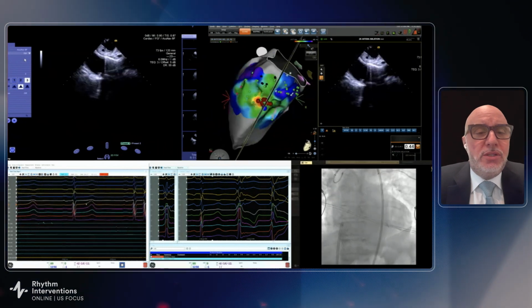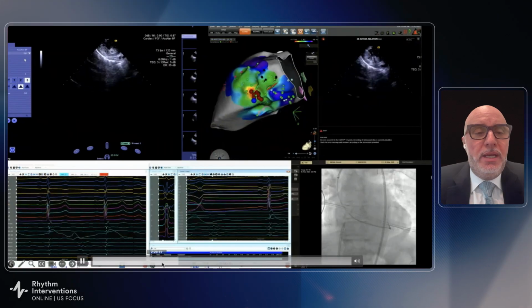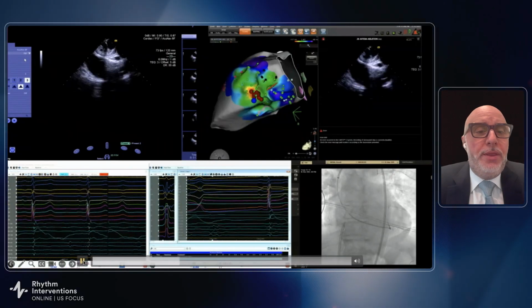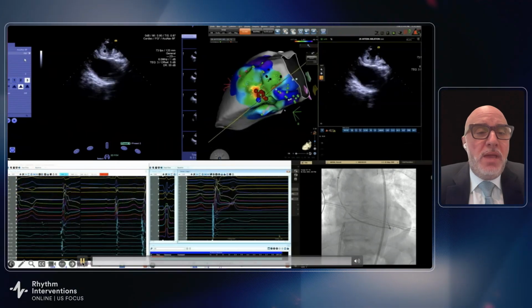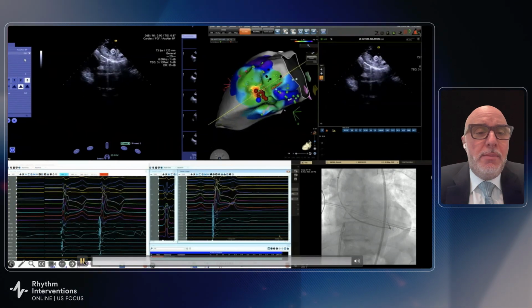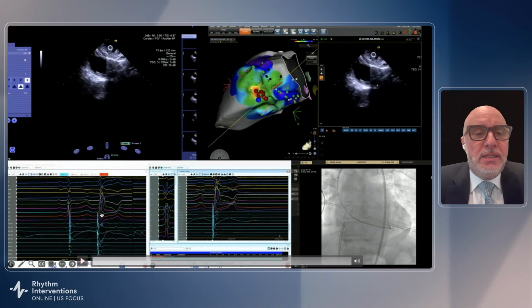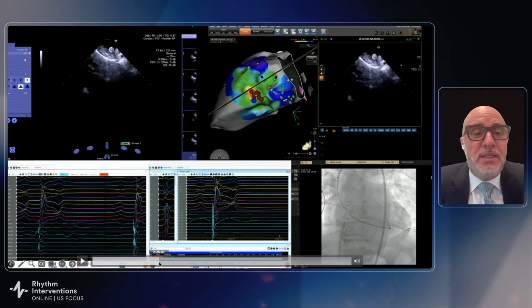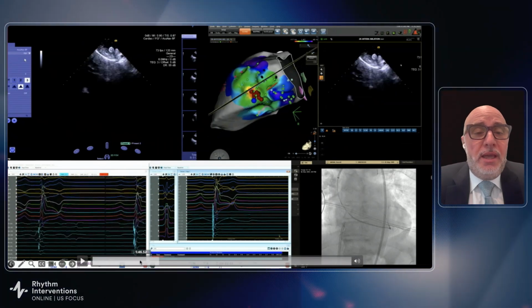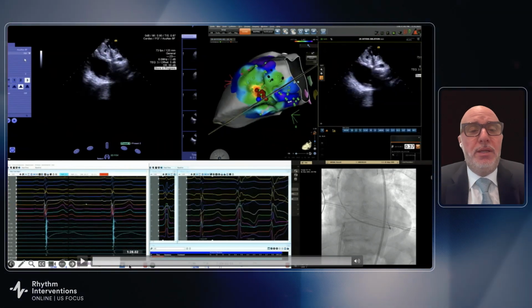And you can see that there was nothing really that would jump into mind for being early on the endocardium. Maybe precursor, decent pace map, but not a perfect pace map. And you can see this is catheter-induced. The morphology is not even close, because the PVC is QS in the inferior leads, which obviously should start making you think that there's something else.